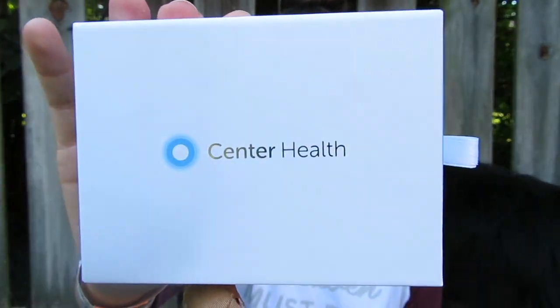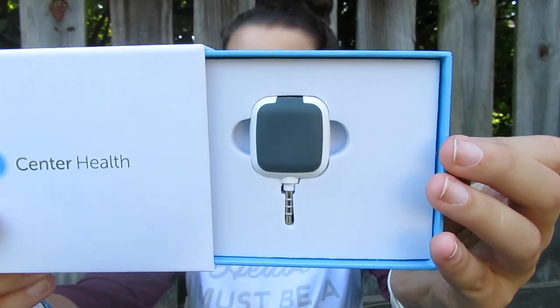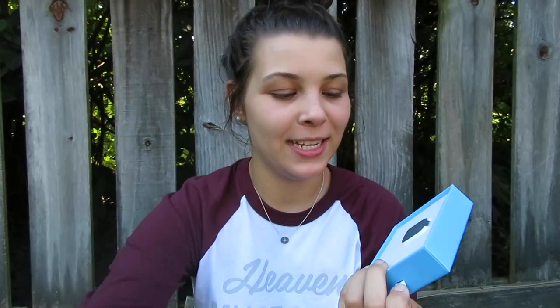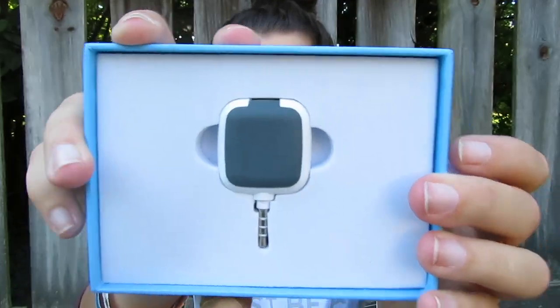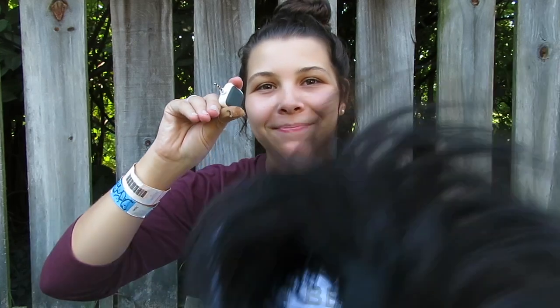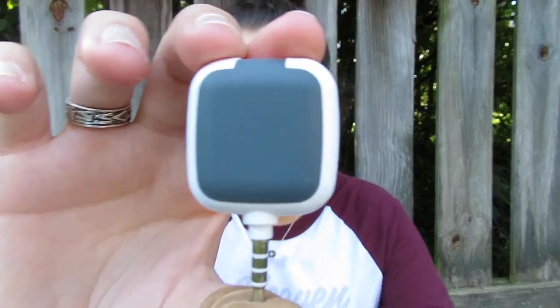Now we get to the exciting part — the glucose meter. This is called the Nano. It's super tiny. You open it and that's it — that's the meter. It's so tiny. I meant to bring my Vario IQ meter out to show a size difference, but honestly this literally just looks like one of those little card readers that you plug into your phone at a farmers market to slide your card.